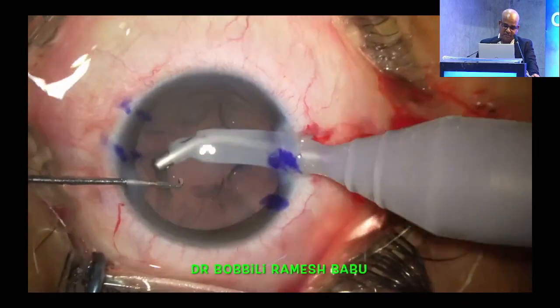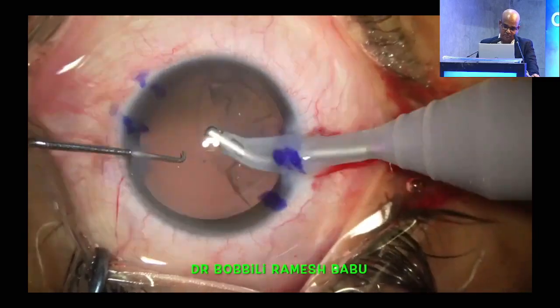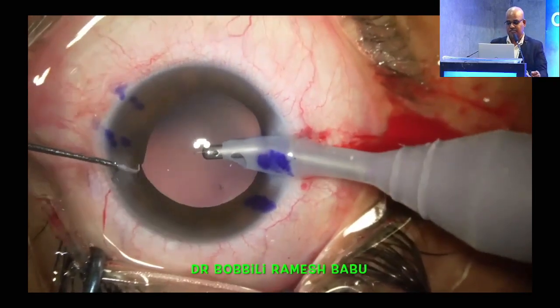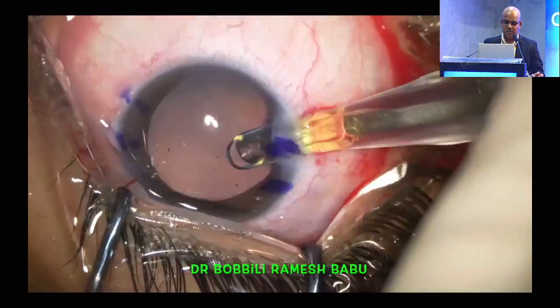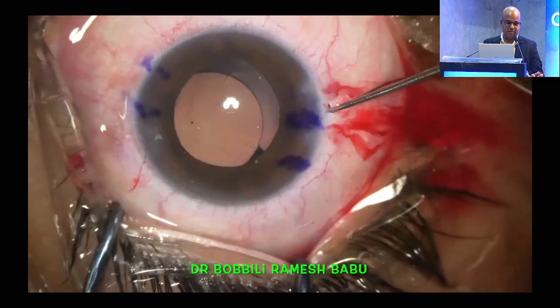Cortical aspiration is being done with coaxial IA. Then the IQ toric IOL will now be implanted.